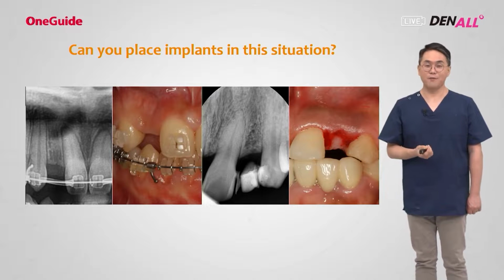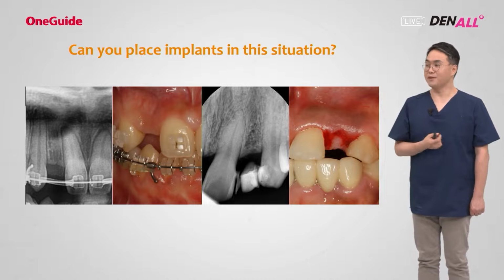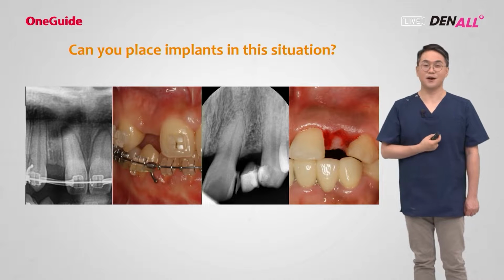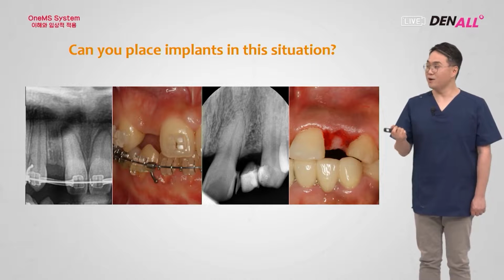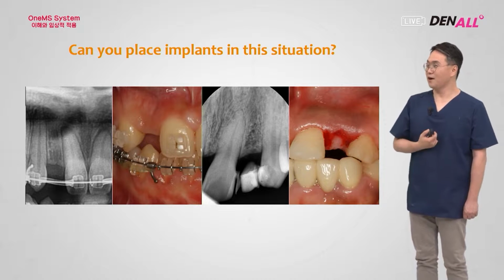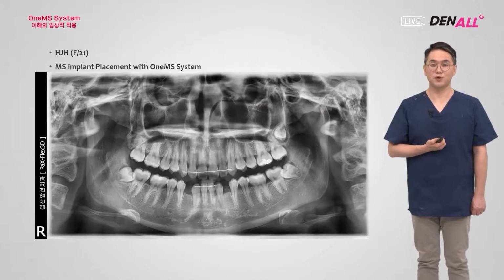Then, once you build experience, you might think you can place the OneMS implant without a guide. But there are cases where you need a guide. If such a patient came to you and said, I want an implant, then what would you do? You could say, I recommend a bridge because an implant is not possible. But with MS, you can place an implant. But even in these cases, placing an MS implant without using a guide is not something I would go for. So let me show you one case.